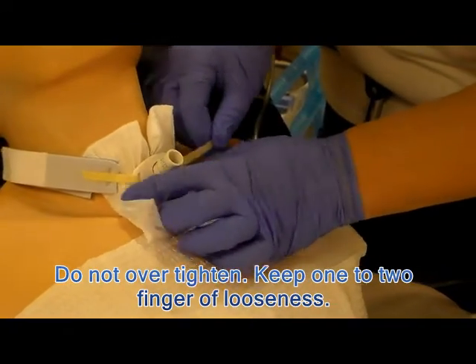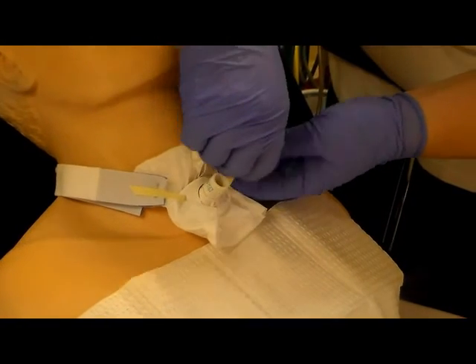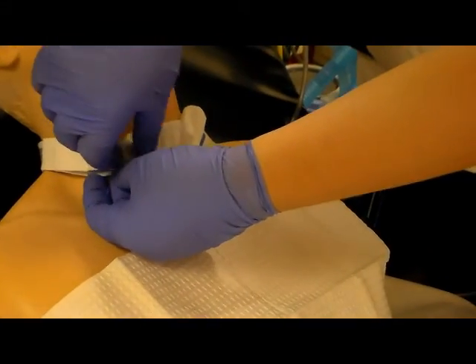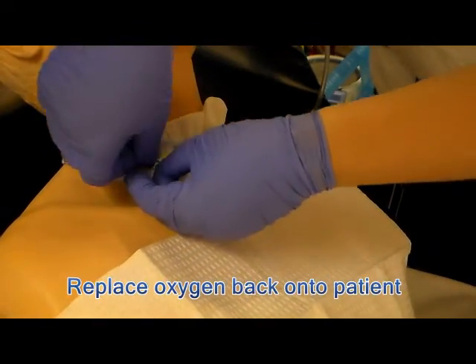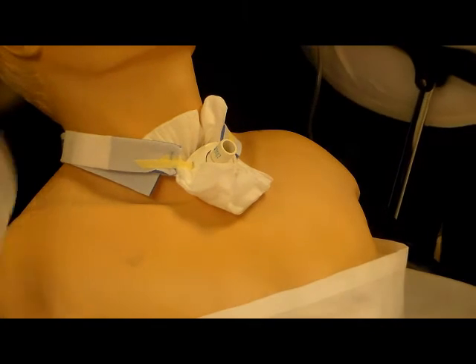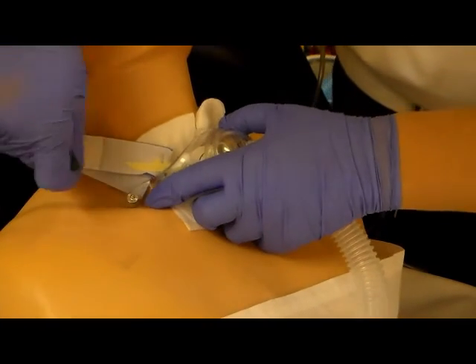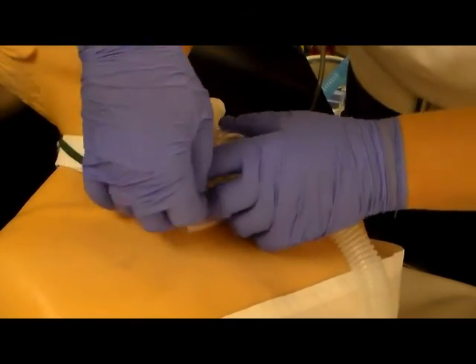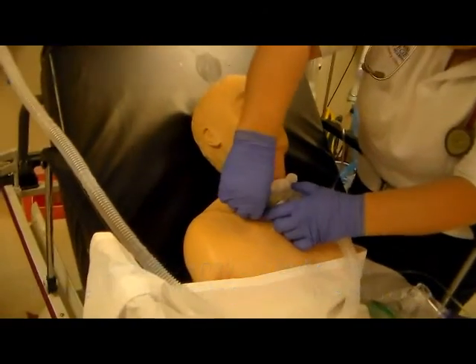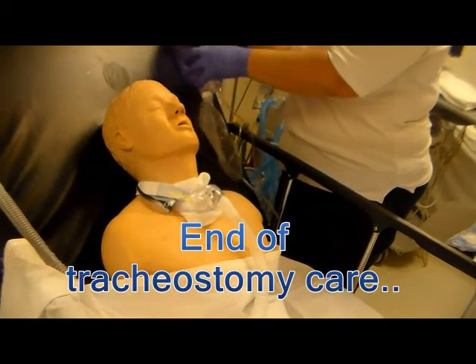Remember you don't want to over-tighten the tie — you want about one to two fingers of looseness between the tie and the neck. If it is too loose, tighten it up a little bit. Then remove the old tie and your sterile drape, and place the oxygen back on the patient. If the gauze is bunched up, straighten it and make sure it is in the proper position. Assure that the patient is comfortable and that their monitor settings are what they should be. That completes the trach care. Thank you.